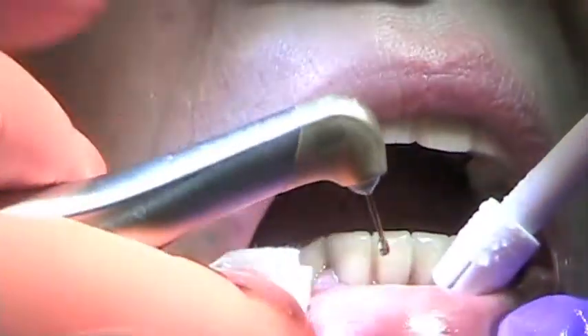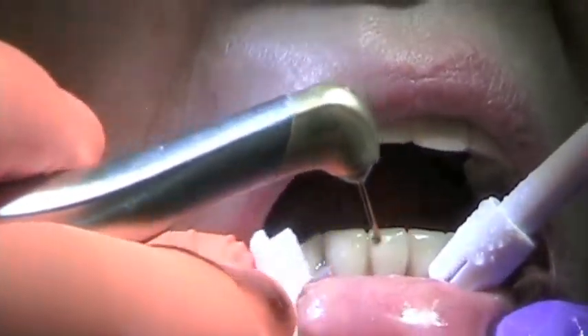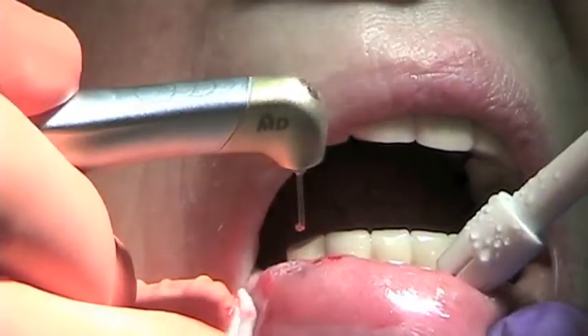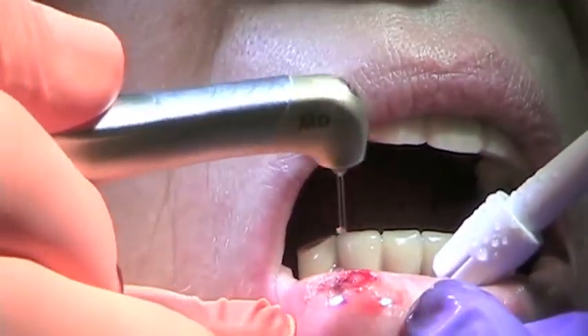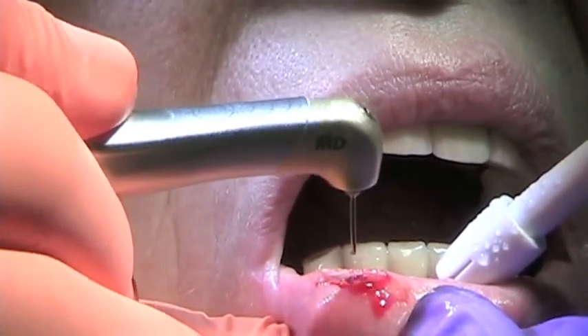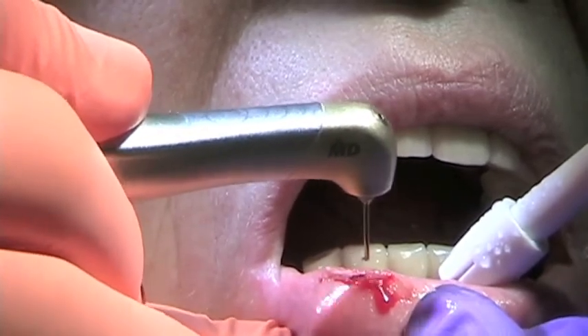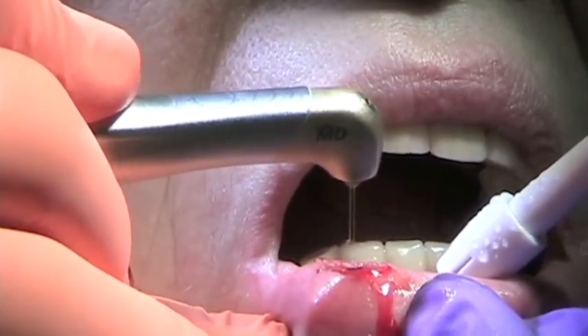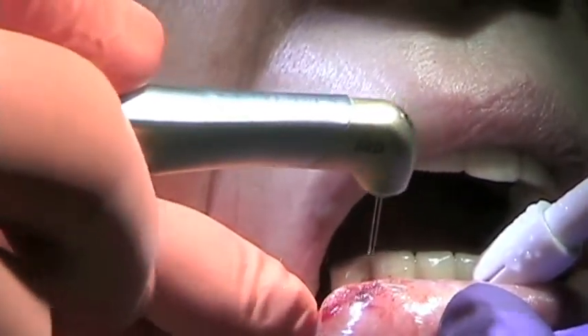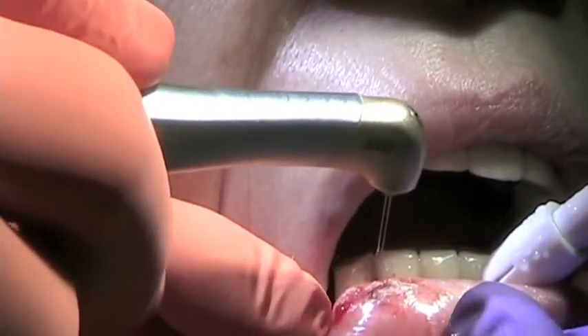Okay, let's put a laser bandage on that, so we're not going to need to do any stitches. Okay, let's do it.